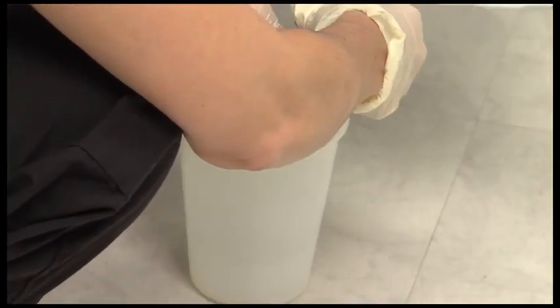Drain the urine into a separate clean collection container for each patient. Do not allow the spigot to touch the sides of the container. Follow hospital policy for emptying the Foley bag prior to transporting a patient.